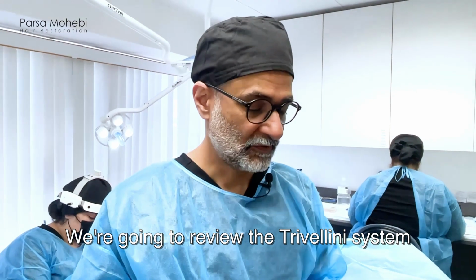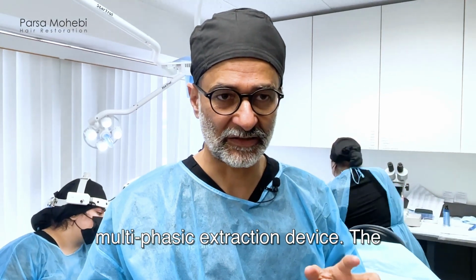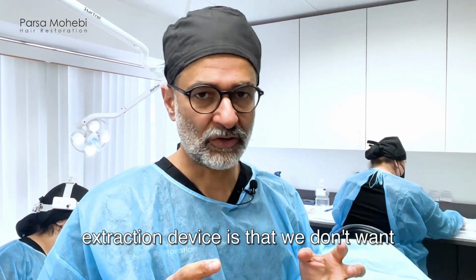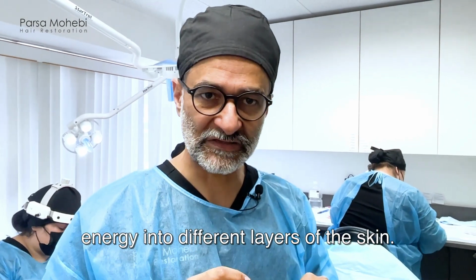We're going to review the Trivellini system and how it works. Trivellini is a multiphasic extraction device. The reason we need a multiphasic extraction device is that we don't want to go with the same speed and same energy into different layers of the skin.